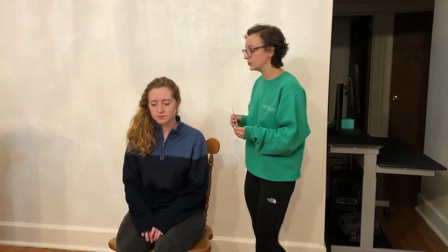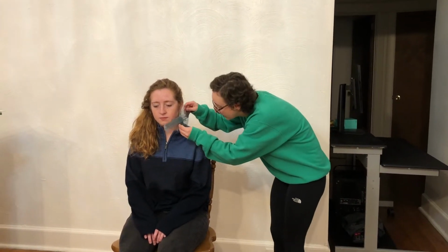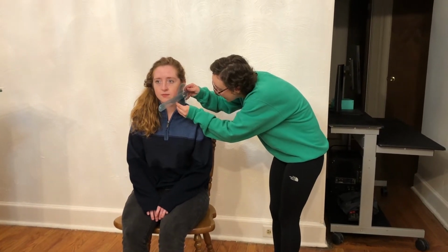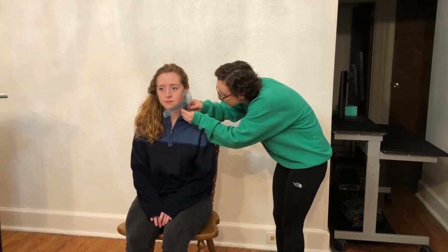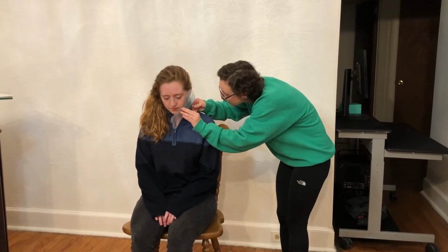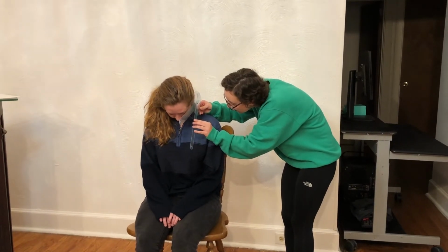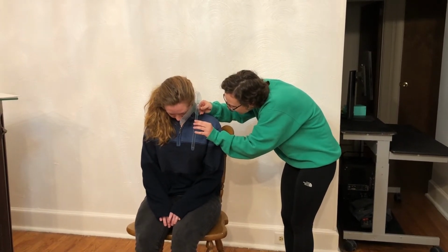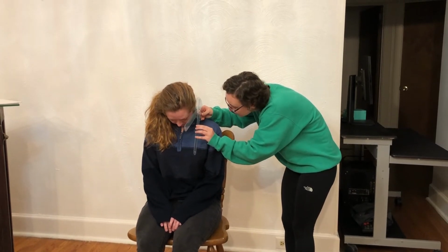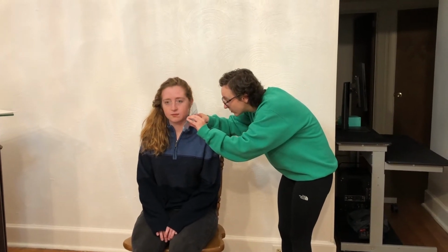First I'm going to do cervical flexion, so I'm going to go ahead and line this up here with your chin. And what I want you to do is bring your chin down to your chest. Okay, great job. We got about 46 degrees.